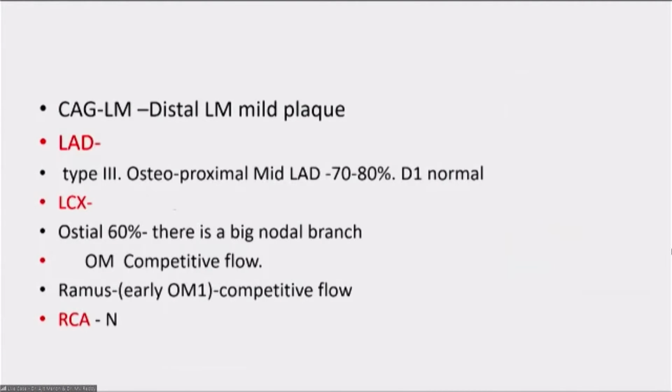We will go ahead with the angio, but the overall picture is that the distal left main has mild plaque, and the LAD is type.